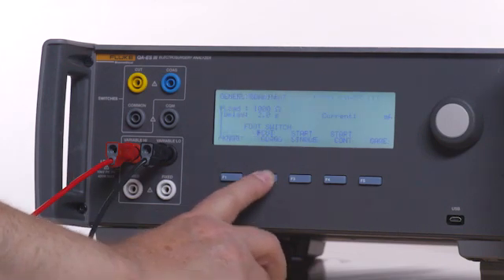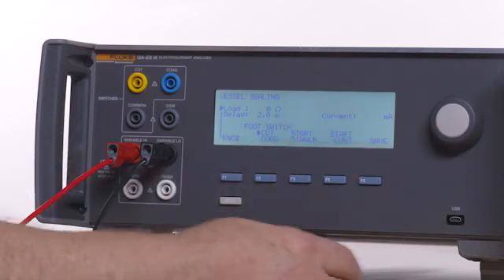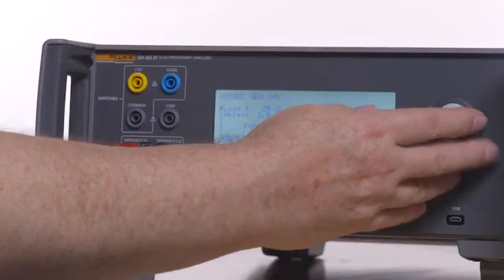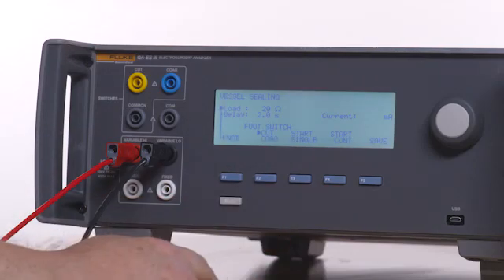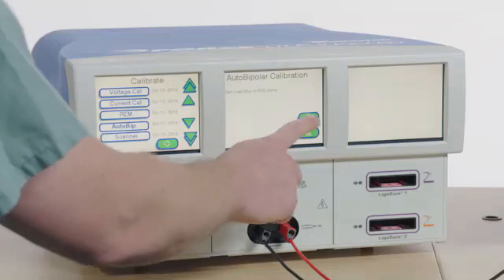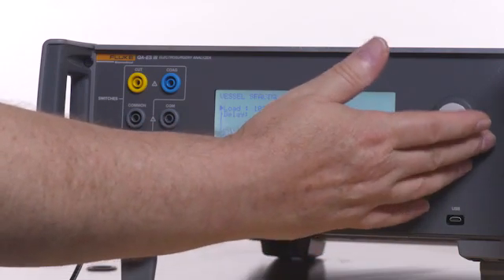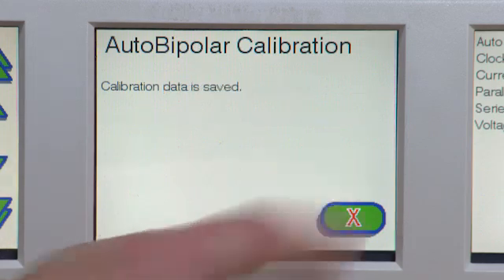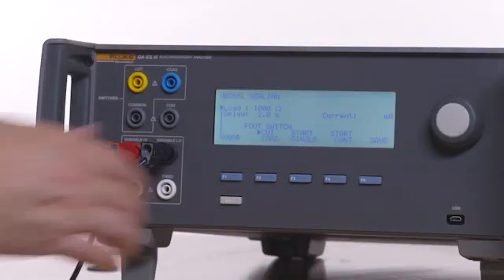Press the back button and then F2 for vessel sealing. Follow the on-screen instructions on the Force Triad to change the load on the QAES-3. Press F4 for start continuous, then select Next on the Force Triad. When the on-screen instructions have been completed, select the red X on the Force Triad to exit. Press F3 on the QAES-3 to stop the test. Remove the test leads.